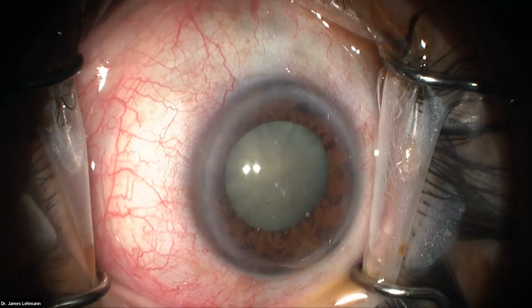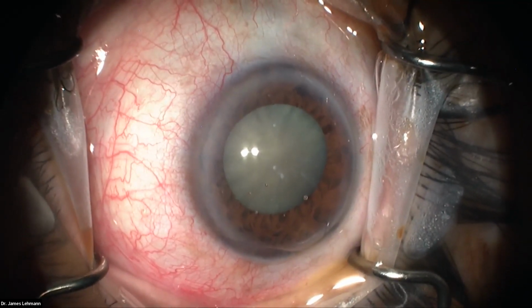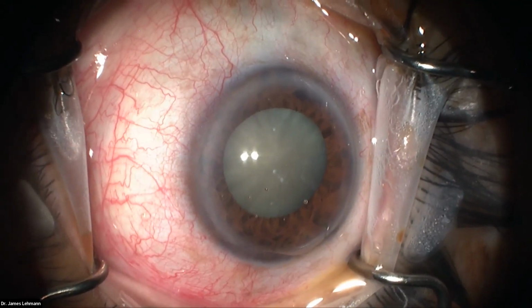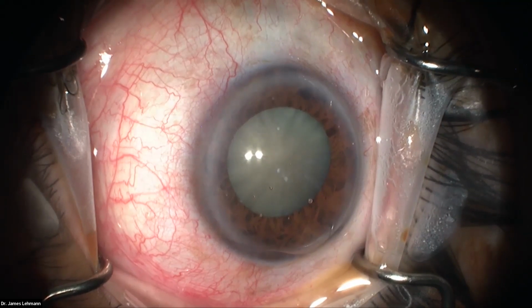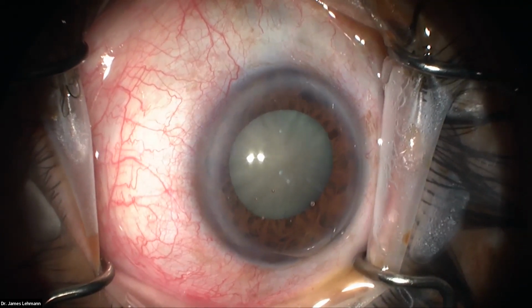Thank you. Okay, guys, so you can see here the patient has a mature cataract, and in our surgery center, we do a timeout before every case to confirm the eye. So we have a left eye prepped, and then we have a 21 diopter lens. We confirm that. We normally do that before we sit down, but just because of the webinar here, we did it when I was sitting.